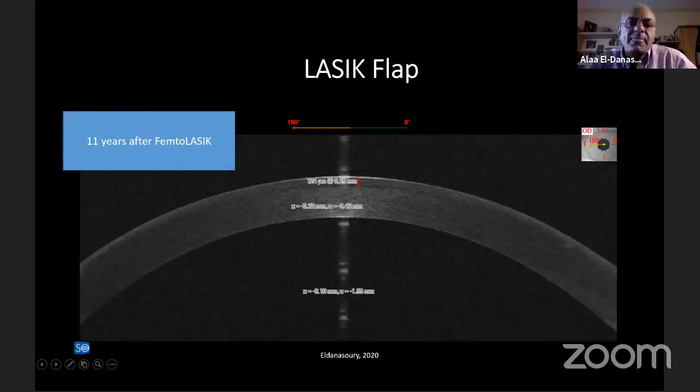Now, moving to post-operative assessment of refractive surgery patient, if you're doing laser vision correction, then you have this patient who had LASIK like 10, 15 years ago, especially if it's not done in your place, you don't know the thickness of the flap, you definitely need to know the thickness of the flap. With the MS39, you can get accurate measurements of the flap thickness down to up to 15, 20.